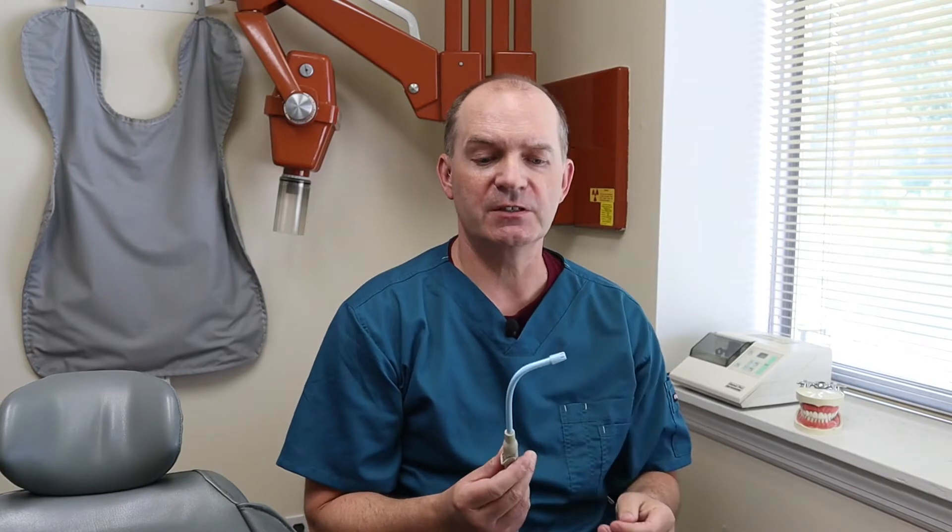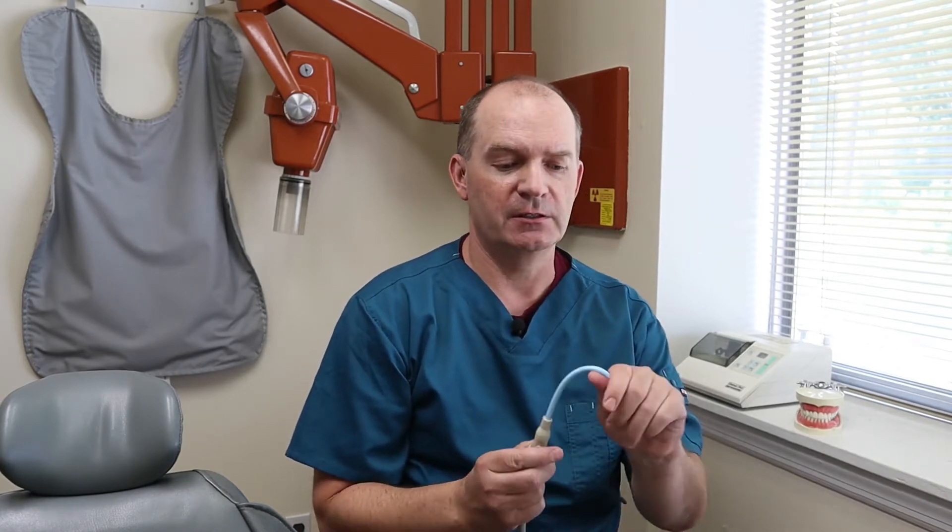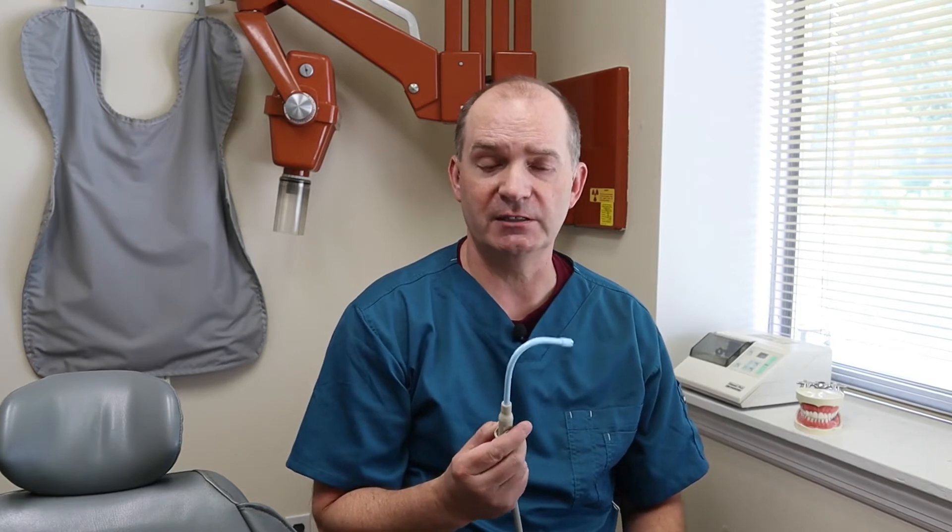We basically have two different types. One is the slow speed suction, also called low volume suction. This is the typical one that's used when you're getting your teeth cleaned. It comes with a little bendy tip on top, so it can be bent whatever shape the dentist or the hygienist needs. Turn it on, and it just gently sucks up your spit as you're getting your teeth cleaned.